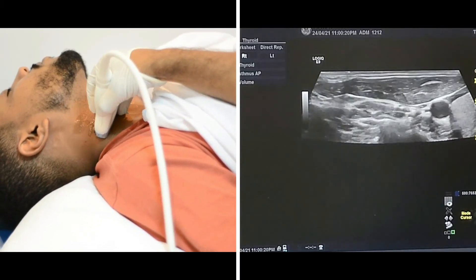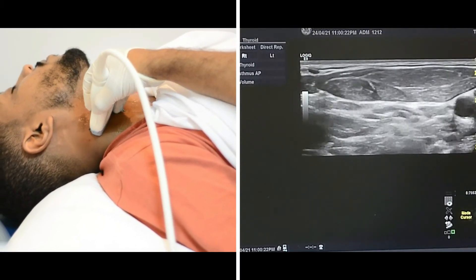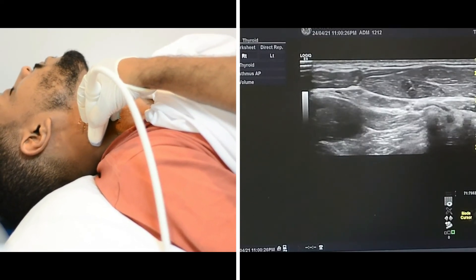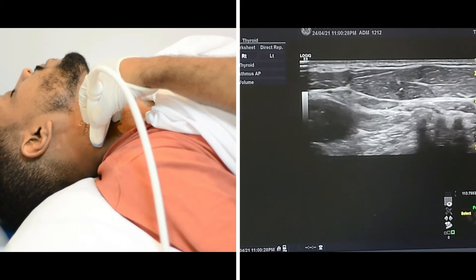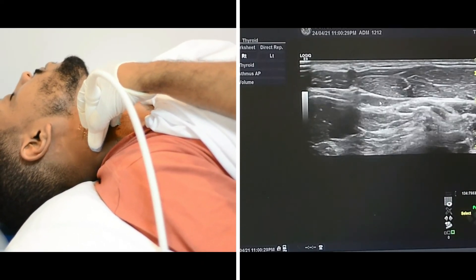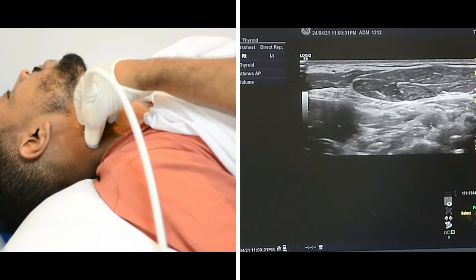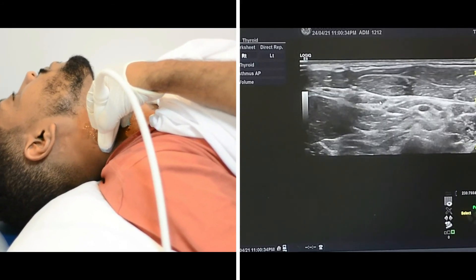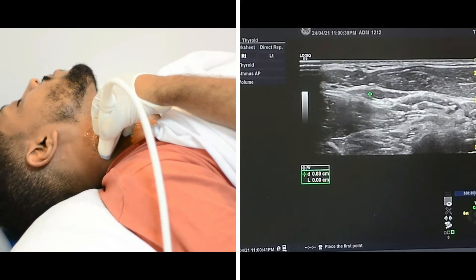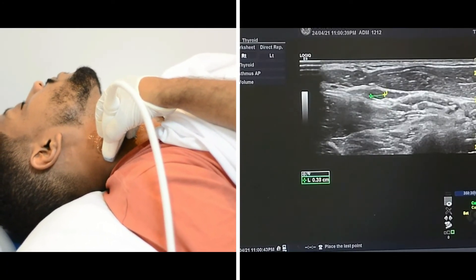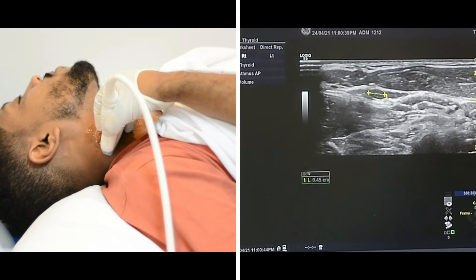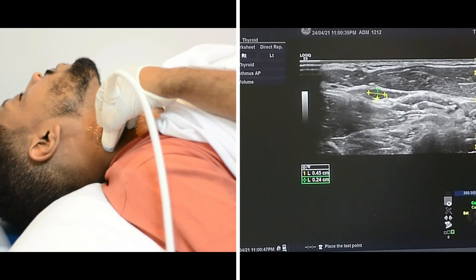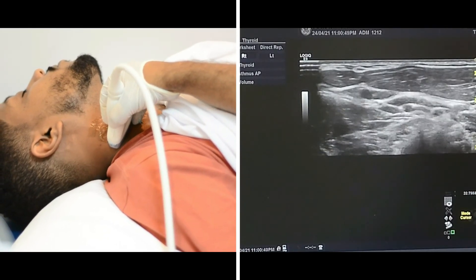I will start by placing the probe here. As we can see on the screen, we have multiple lymph nodes — sub-centimetric, with preserved fatty hilum. You will measure either the width or the AP diameter, whatever measure you rely on.